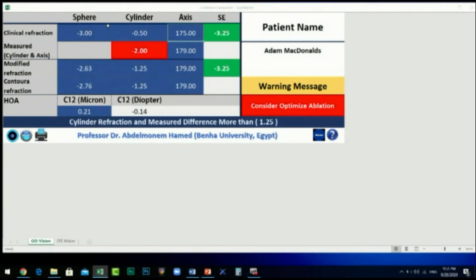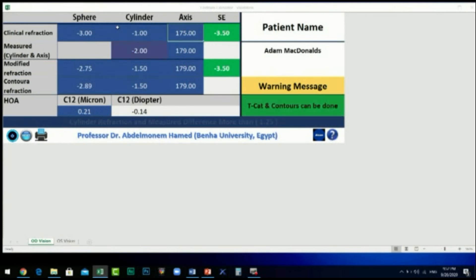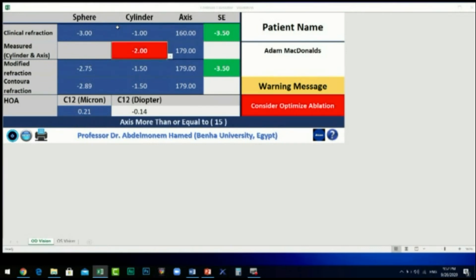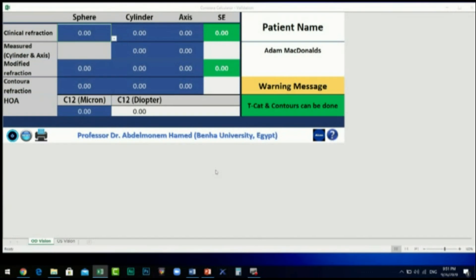To demonstrate what happens when we violate the Alcon pre-calculation considerations, we enter a clinical refraction cylinder power of minus 0.5 diopters. The warning sign then highlights in red and says: consider optimized ablation.